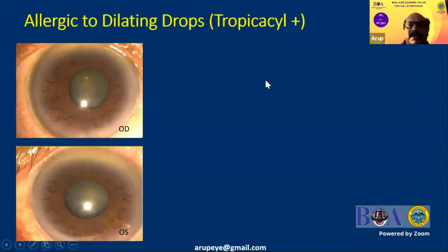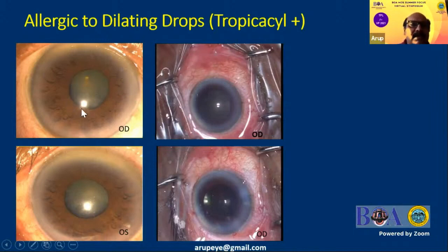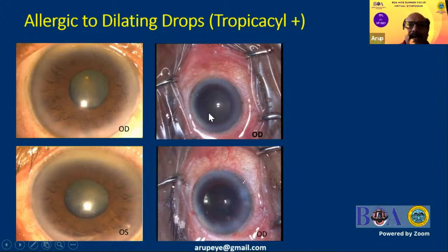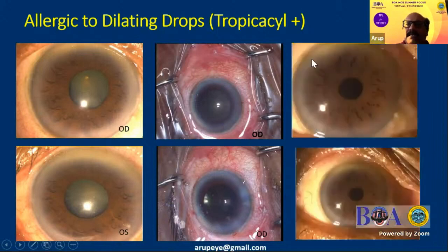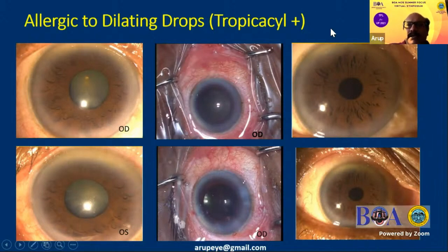Sometimes I get pupils like that on the surgical table and nurses say the patient is allergic to tropicacyl plus, so only homatropine or cyclopentolate was used. But what I tell my staff is that on the day of surgery it is still possible to use tropicacyl plus drops. Without the phenylephrine component the dilation was sub-optimal, but when I added it, I got an adequate pupil size and safe phacoemulsification was performed. On day one, topical steroids are given six times a day, so the allergy factor really doesn't come into consideration — and in the bargain you get a well-dilated pupil and can avoid pupillary devices.